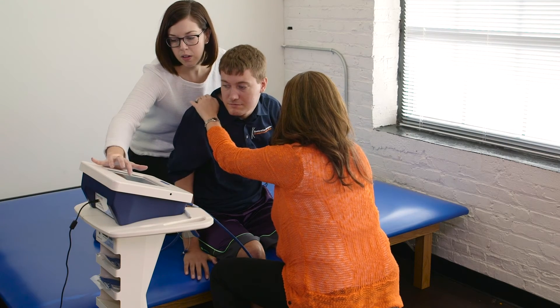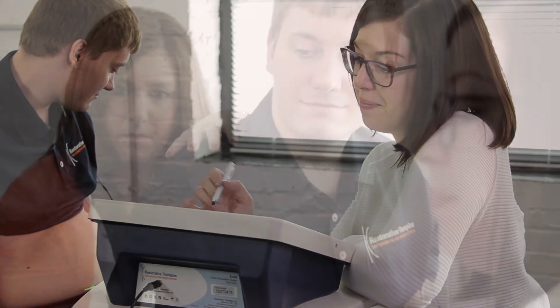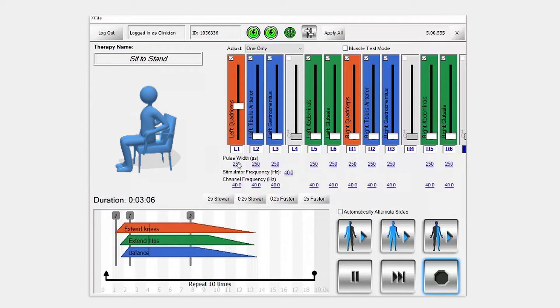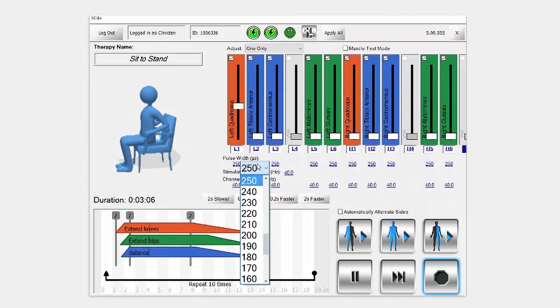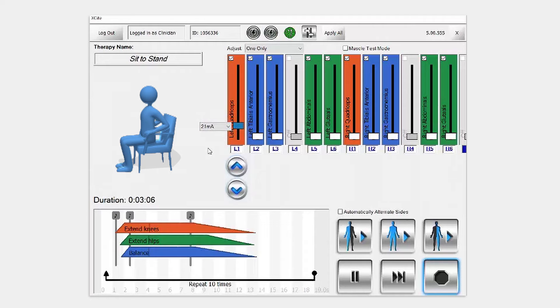When you select a therapy program for your patient from one of the three libraries, you can use Excite's touch screen to customize the settings to meet your patient's specific needs. You can easily turn off stimulation to any muscle not required for your specific patient, and adjust the stimulation parameters for each muscle. For example, here I am adjusting the amplitude of stimulation to channel one in this therapy program for sit to stand, associated with the quadricep muscle.